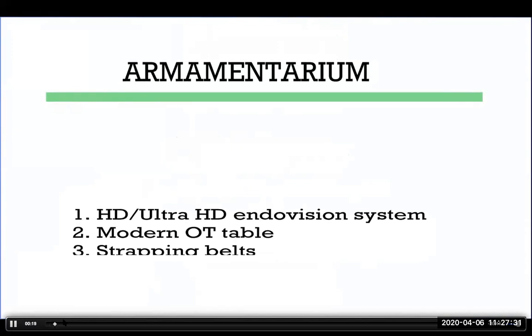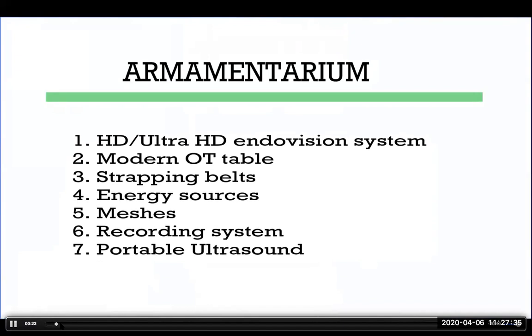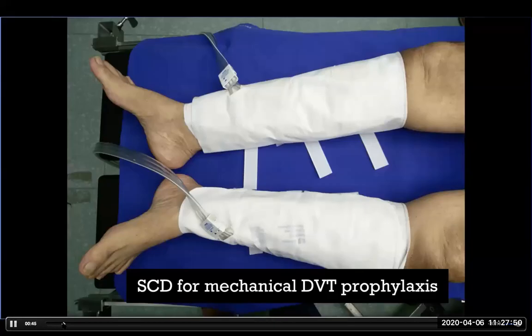You basically need a modern OT table which can be flexed. You must be able to strap the patient. You must have bipolar, monopolar, maybe a LigaSure or Harmonic. You must have a very good quality imaging system. Now you have 4K. HD is pretty basic today.